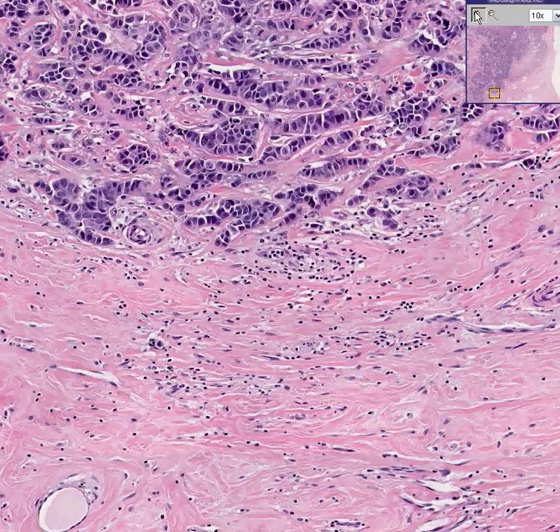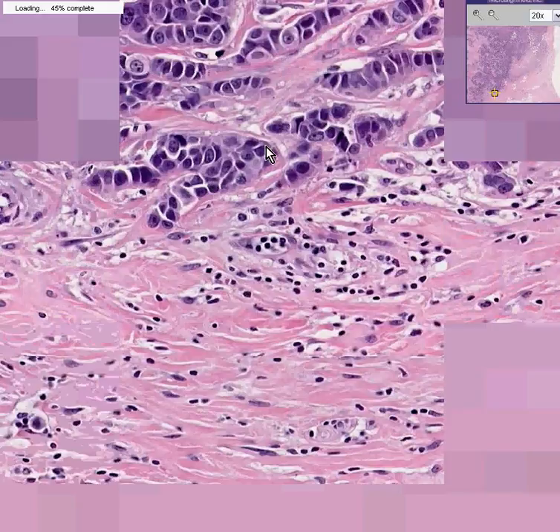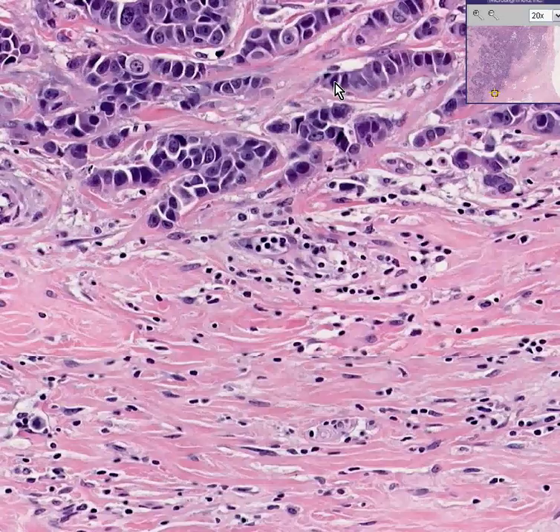And in addition, if you would like to go up to high power to the nuclei, which all the neophytes do, you could see that these infiltrating cells are not uniform. Some are much, much darker than their neighbors, and some are much, much bigger than their neighbors. This is the general concepts of hyperchromasia and pleomorphism, respectively, which you see with most cancers, including many or most of the breast cancers.